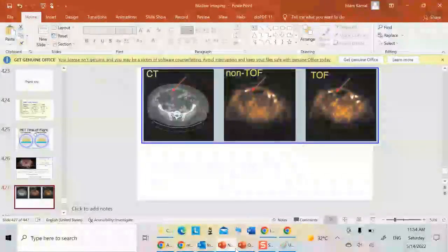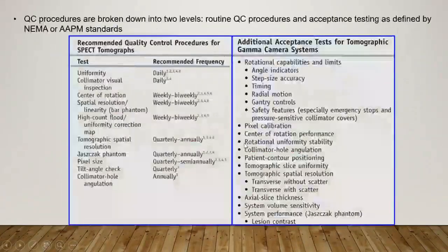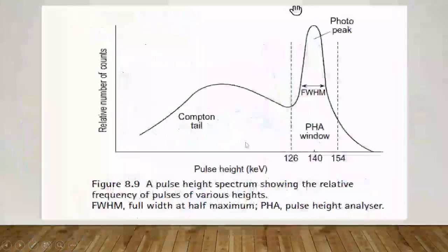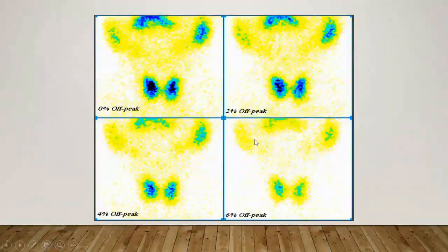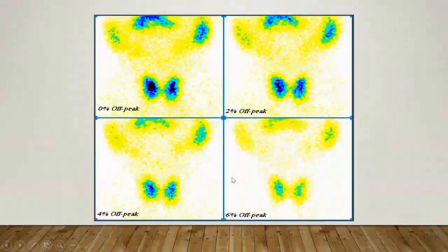There's also a point before we move on to the topic. This image is a thyroid image, right? All the thyroids should have the same appearance, but in this image, you can see 4 images with different appearances.